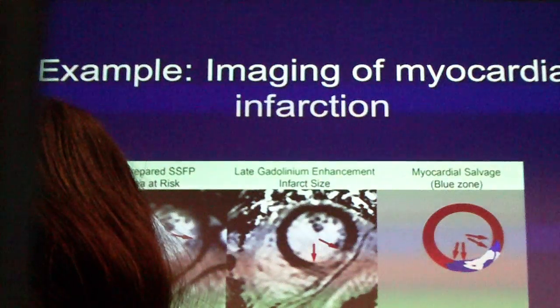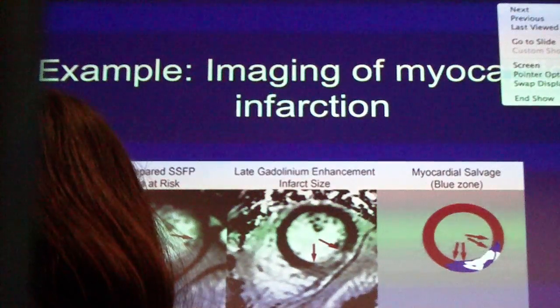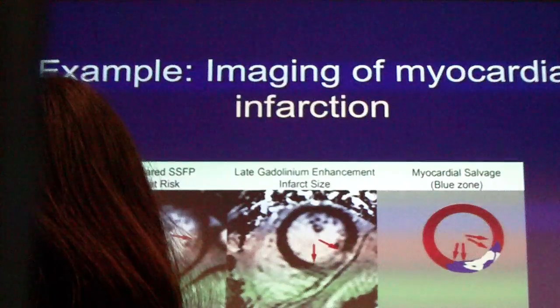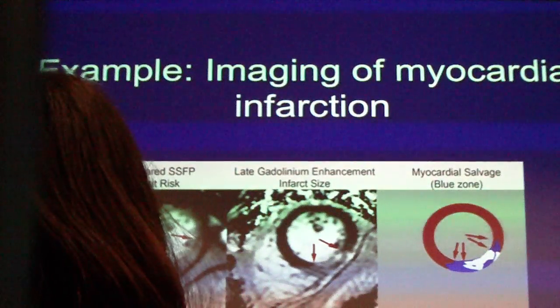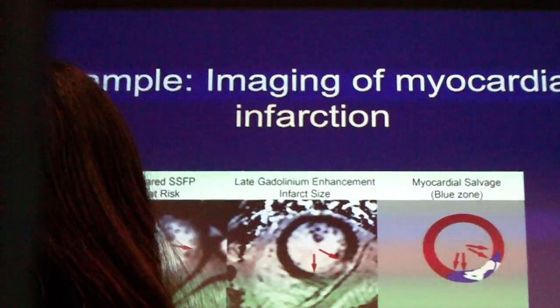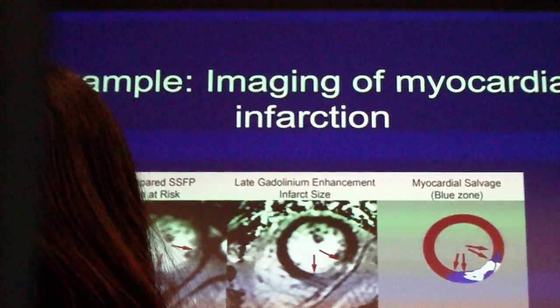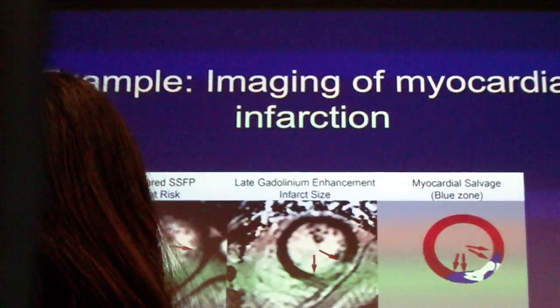Now, what you can also do to make an infarct visible is that you give the contrast, as I said, so gadolinium contrast is decreasing your T1, meaning that blood is getting very bright. And it also makes intensity of infarcted area brighter.